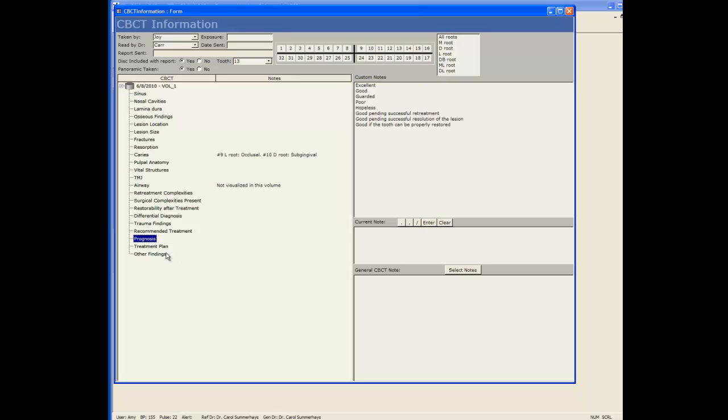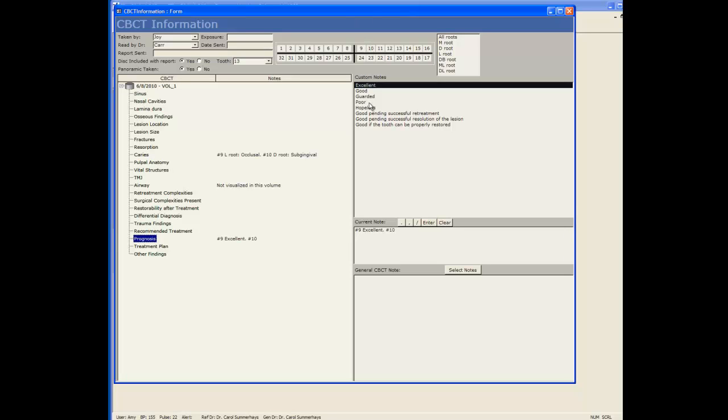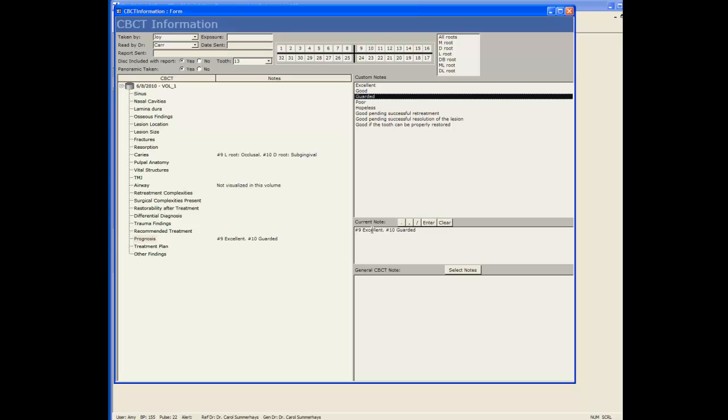I'm going to do prognosis. This I'm going to do tooth 9 is excellent, tooth 10 is guarded. And again as I'm clicking you can see it build and also show on the left.